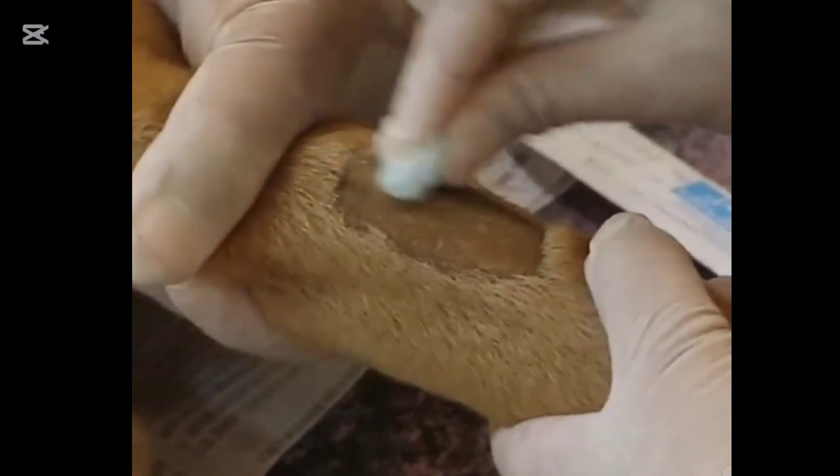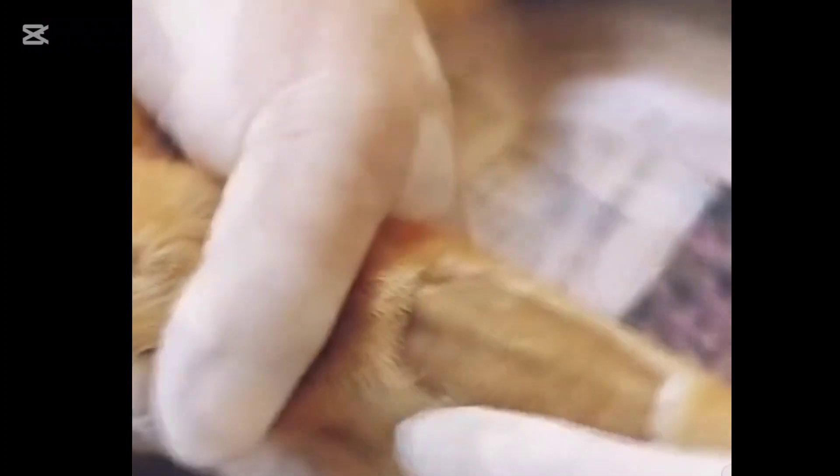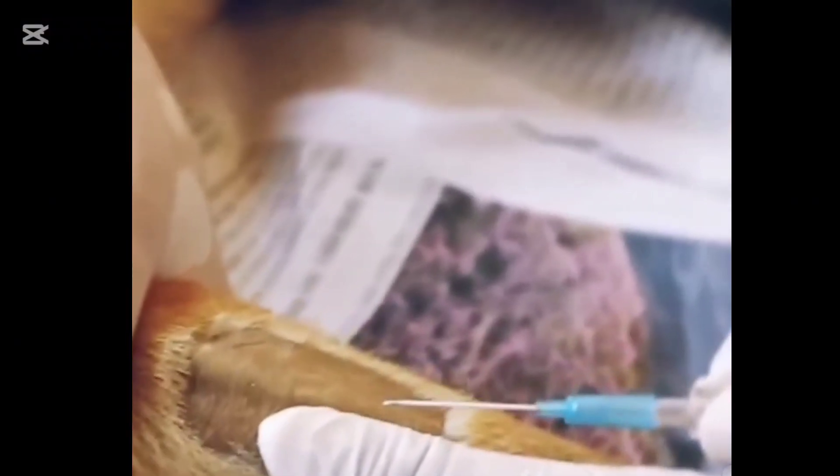Using an alcohol wipe after the assistant raises the vein can make it more visible. You can place your non-dominant hand under the dog's leg, using your thumb to stabilize the vein. Pulling the skin taut also helps prevent the vein from moving around. Enter the skin first, then lower the angle before entering the vein — this lessens the risk of passing straight through and blowing the vein.